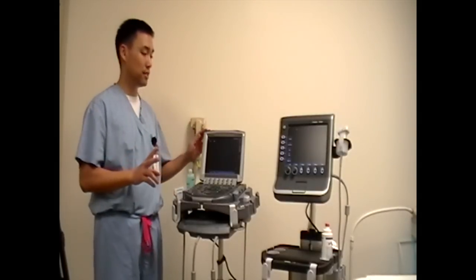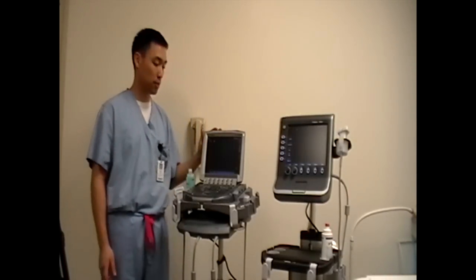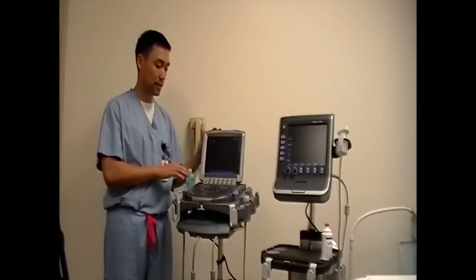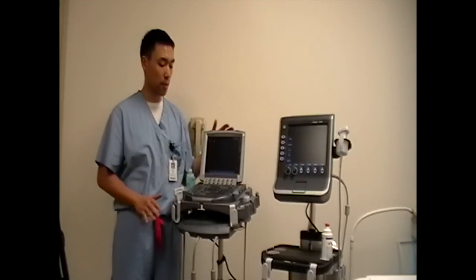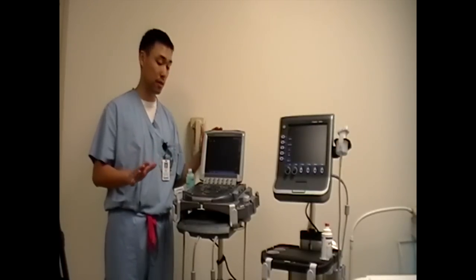So we have two machines in the PDX lab. This is called the S-Fast machine, and this is the M-Turbo machine. This machine has a lot of buttons. This one has fewer buttons, but the main buttons that you'll need to know is just five buttons, and I'll tell you about them in a little bit.